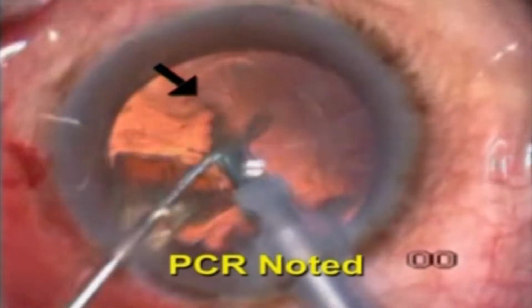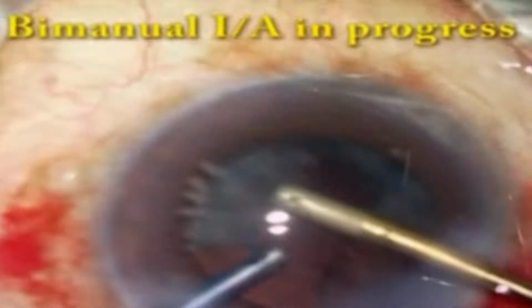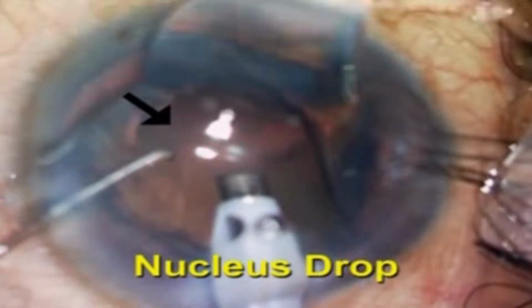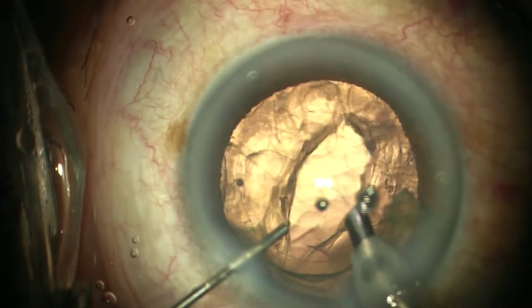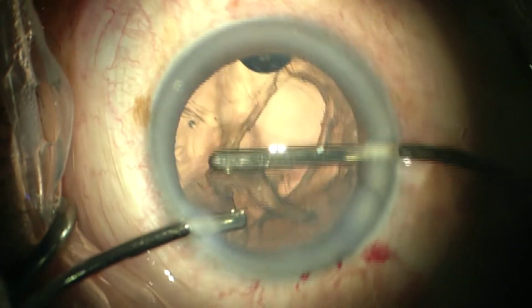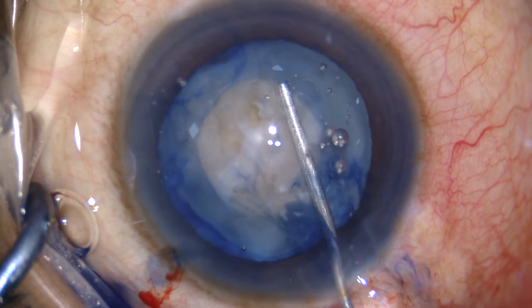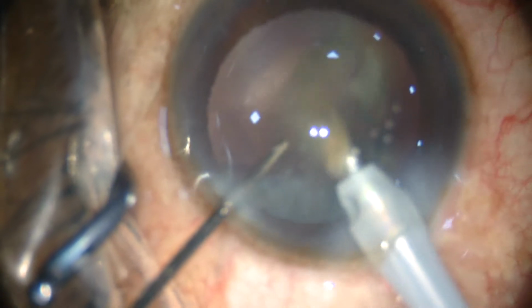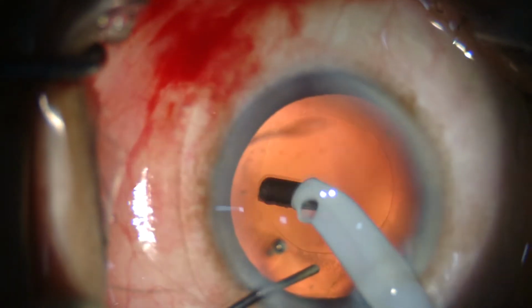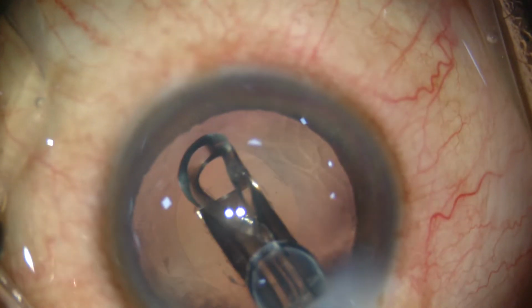Early recognition combined with advances in instrumentation have enabled effective management of posterior capsule rupture and vitreous loss during phacoemulsification. Posterior capsule rupture can occur at any stage of phacoemulsification. For example, during hydrodissection, nucleus removal, cortex removal, posterior capsule vacuuming, and during IOL implantation as well.